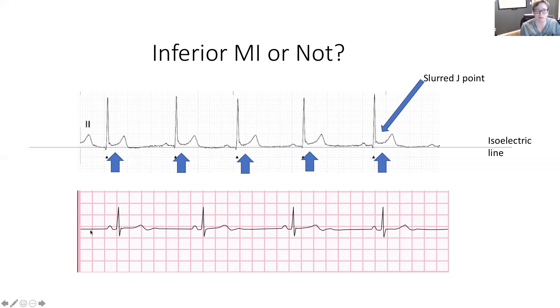On the bottom strip, we have another bradycardia — a P wave, QRS, and you see how it comes back to the isoelectric line, then a T wave. We do have a little bit of a reversal here, which can be a physiological U wave. It may be pathological or it may be a normal physiological thing. What I really want to highlight here is the difference in the ST segment.